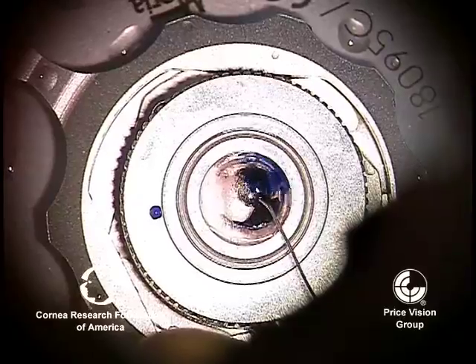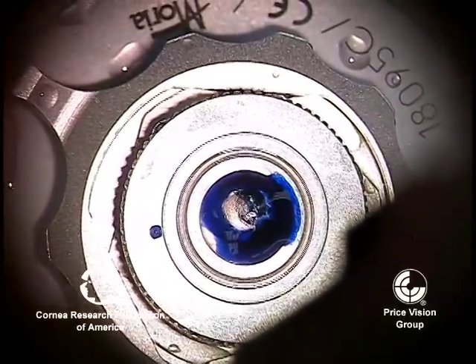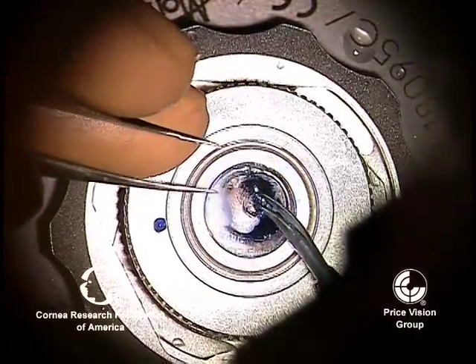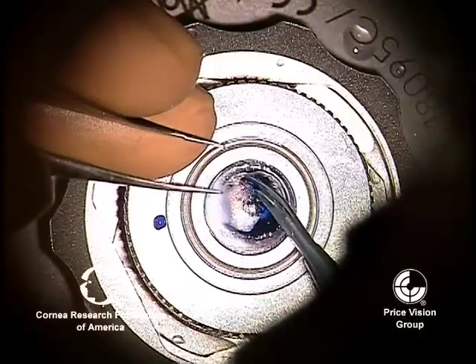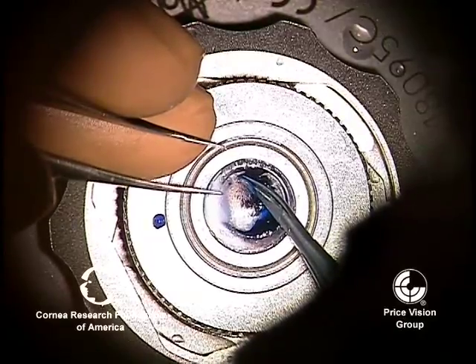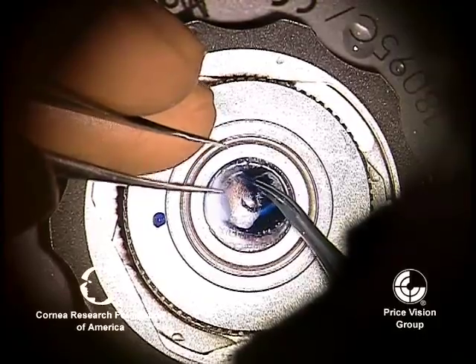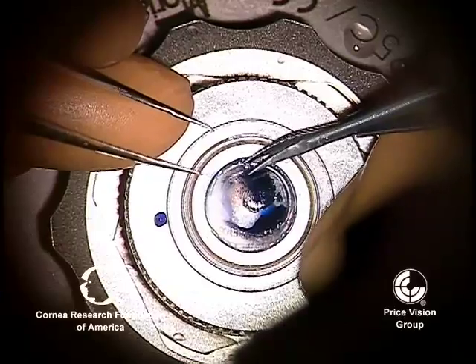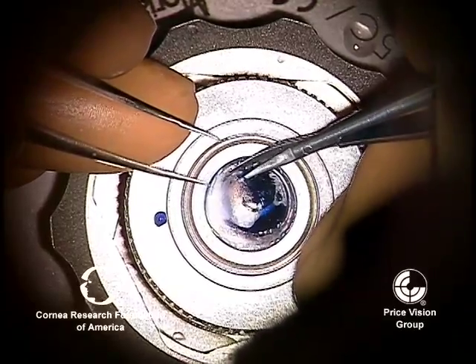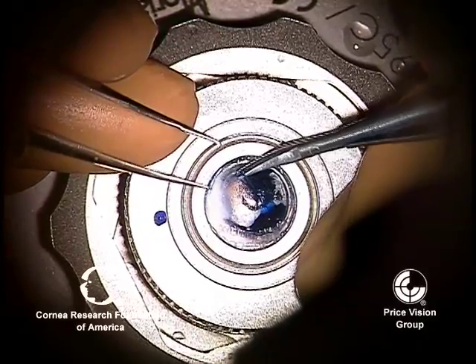You get a nice separation, and then we like to put some Vision Blue inside the big bubble itself. That stains the edges of the big bubble so that when you go around with the scissors, you can tell where the edge of the bubble stops, so that you don't cut Descemet's membrane. If Descemet's membrane is cut while doing this, then you will not get it to attach once it's in the patient's eye.